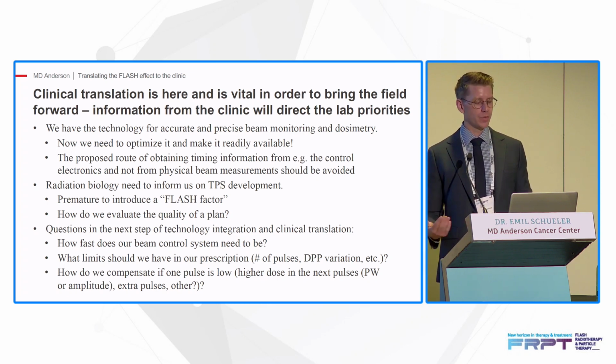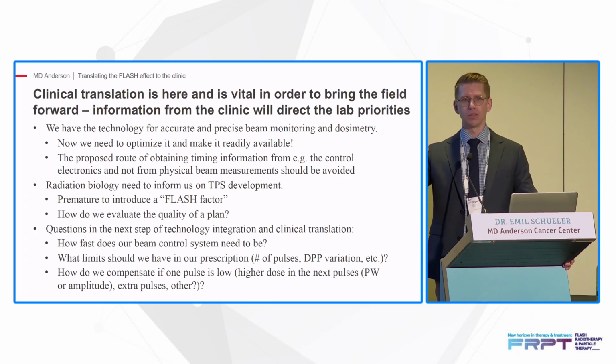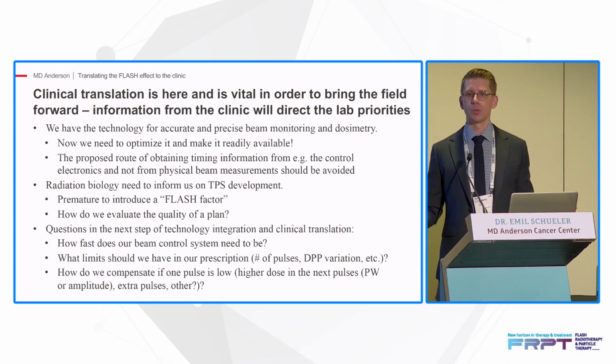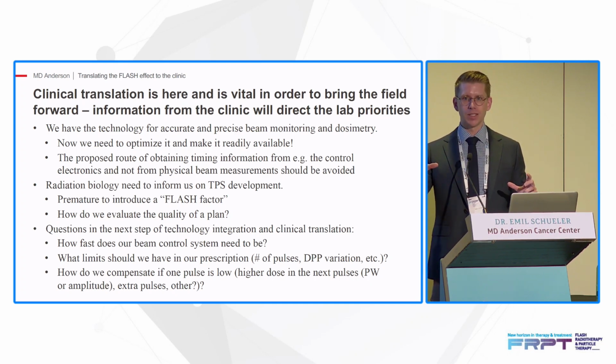Questions in the next step of technology integration and clinical translation. Just again, because this talk was more focused on the technical aspects, like how fast does our beam control system need to be? What limits should we put on our prescription? I think that's going to be very relevant when it comes to just how we set all of that.